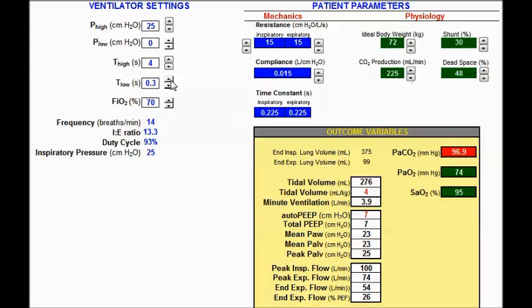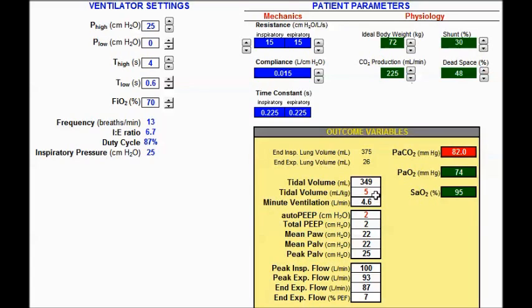Increasing t-low to 0.3: tidal volume is a little higher at 4 cc/kg, still in the safe range, auto-PEEP is less. At 0.4: tidal volume still safe, auto-PEEP less. At 0.5: tidal volume still in the safe range at 5 mL, auto-PEEP down to 3. At t-low of 0.6: tidal volume remains safe, auto-PEEP continues down. At 0.7 and lastly 0.8: similar trends observed.